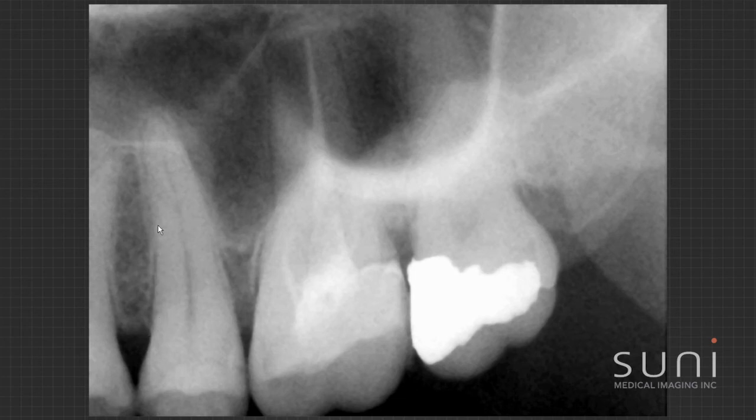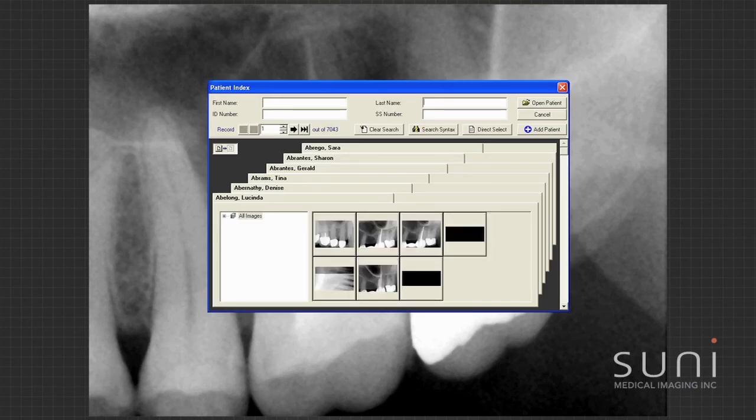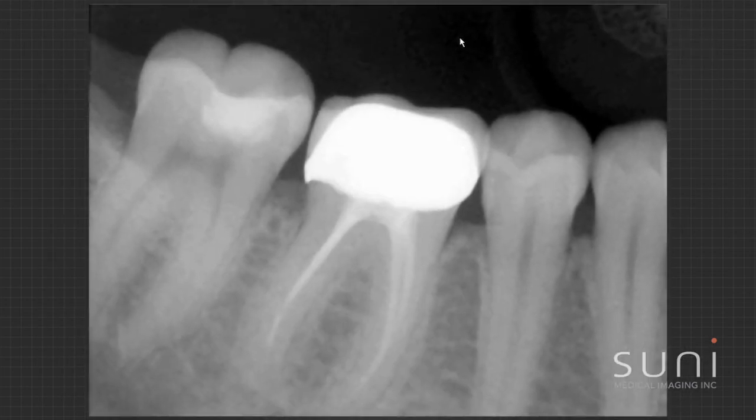Looking at this tooth all the way around, I can see the PDL really nicely. Old root canal may be a little bit short, but not really any periapical pathology. Unfortunately the buccal roots are behind the sinus so it's really hard to tell if there's an issue there. With cone beam technology we can take our diagnosis to the next level if I'm not quite sure, and I've got really good images that give me the ability to diagnose better than before.